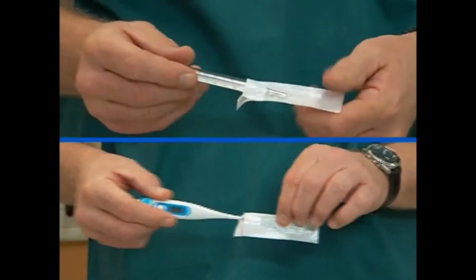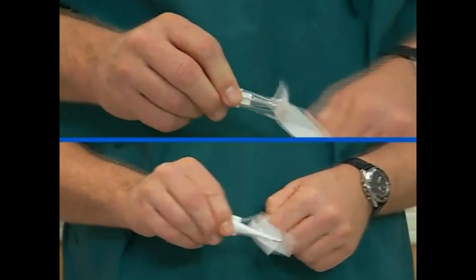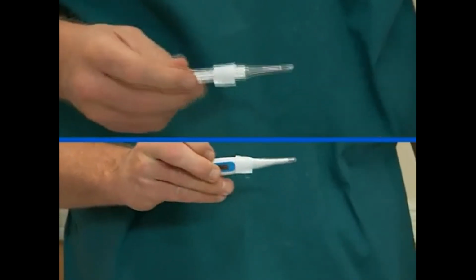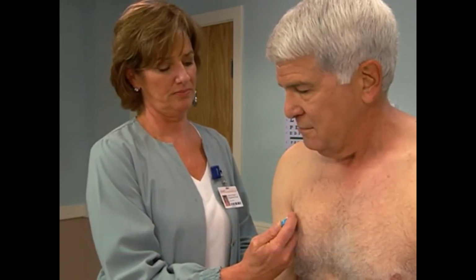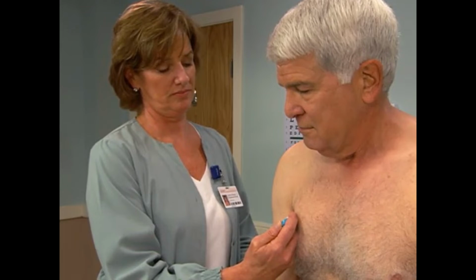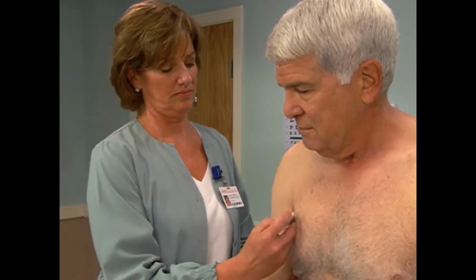When measuring axillary temperatures, prepare your thermometer the same way as when taking an oral measurement. Place the thermometer in the axillary fold. Hold this firmly against your side. This should only take a few moments. Axillary temperatures are considered the least accurate, so to confirm suspect findings, recheck using another method.